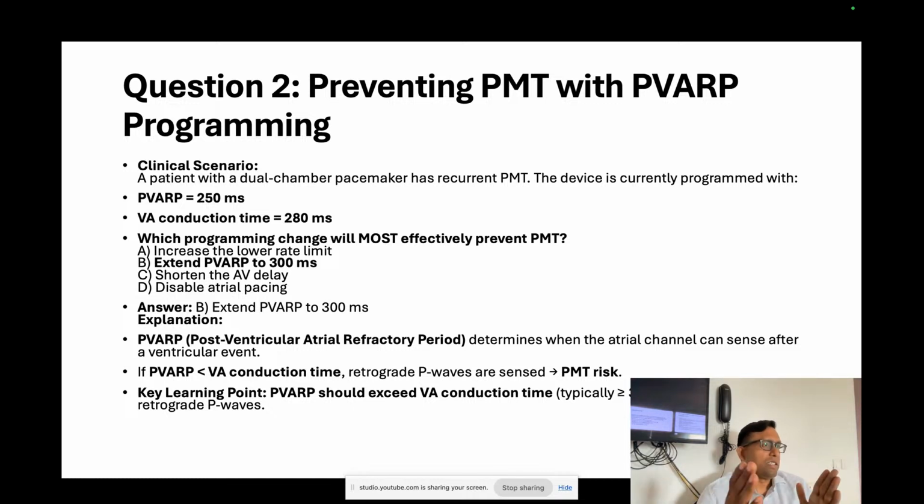Okay, after that this is going to come. But anything which is falling in the refractory period, it is not going to work on the timer of the pacemaker. It is not going to change anything. It has sensed, okay, it will later on say we are seeing some VA activity, but it is not going to change anything. So this is an important concept between the blanking versus refractory. When any pacing is happening, at that time the other lead should not sense anything. For that, the crosstalk has to be avoided, and that's why it is kept in the pacemaker.